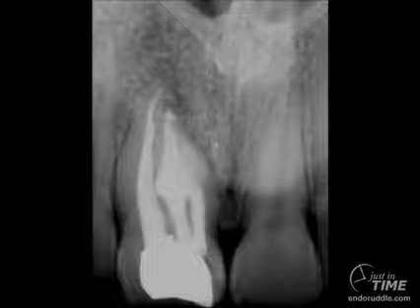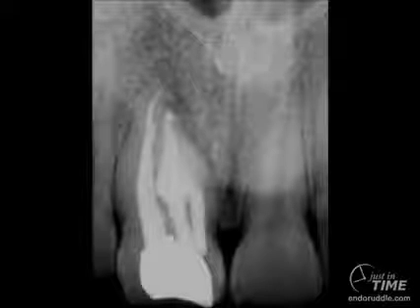We'll skip right to the one-year recall, but Francesco exquisitely restored the tooth, and you can see that restorative work shows up quite nicely radiographically. Francesco's a marvelous operator, and you can see in this recall image that a significant amount of bone fill has healed around the apical region, both apical and laterally. So complete endodontics is an absolute necessity to get bone to heal.